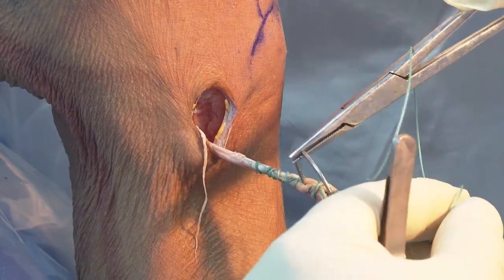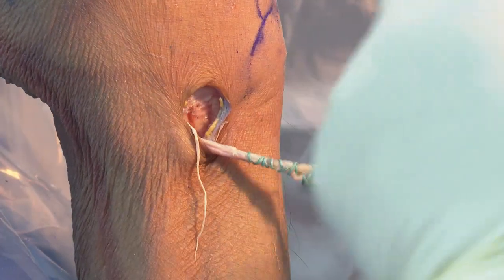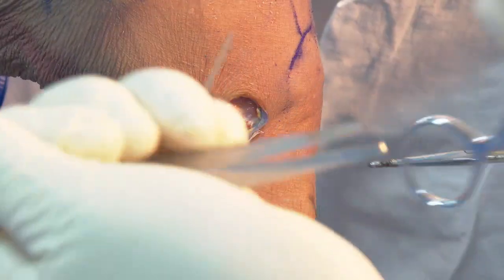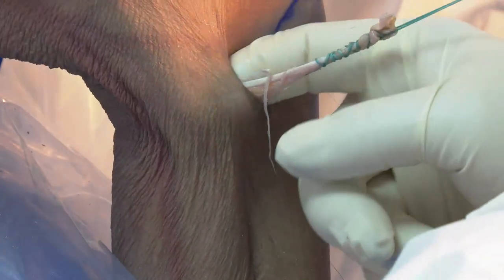Stop with the Mason Allen. Stop that way. Okay. Then always pull. Pull is better because the tip will be smooth, okay? And you can put in the needle better.